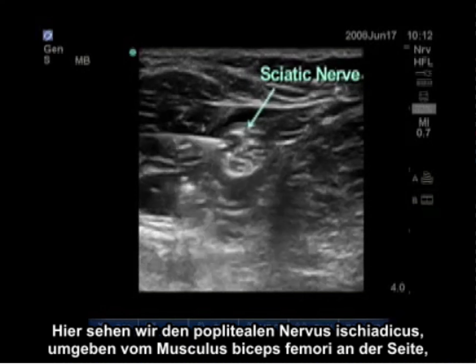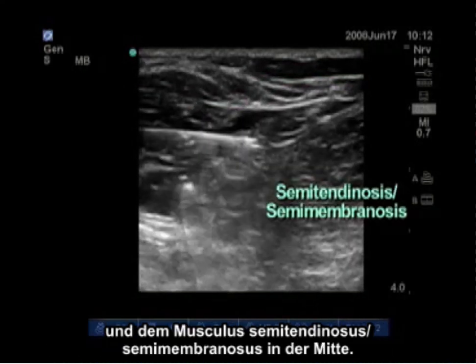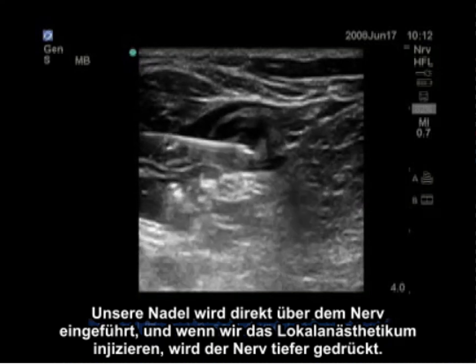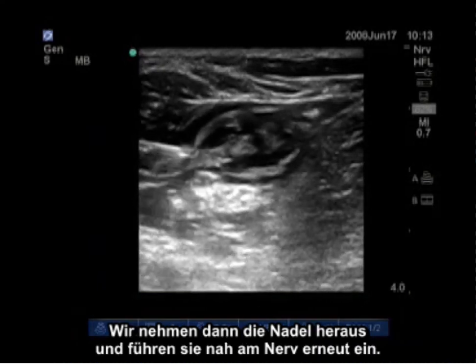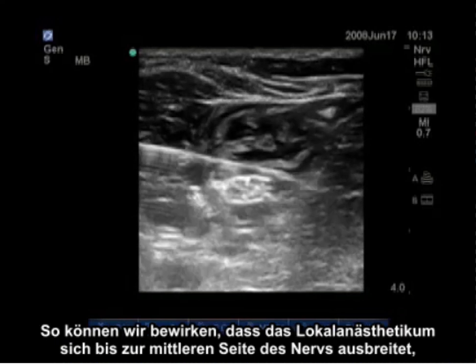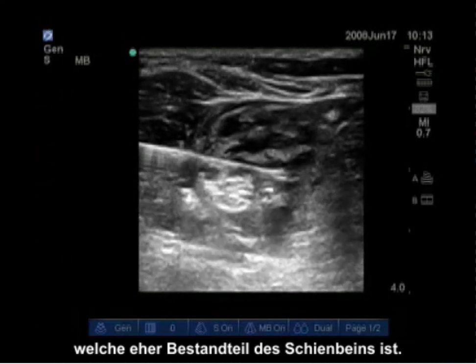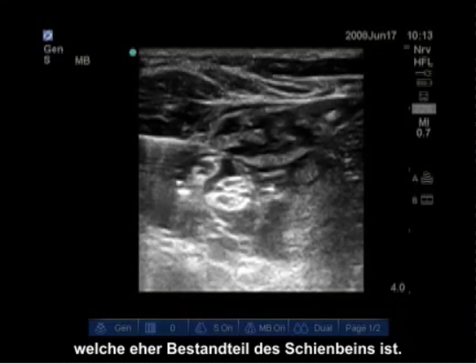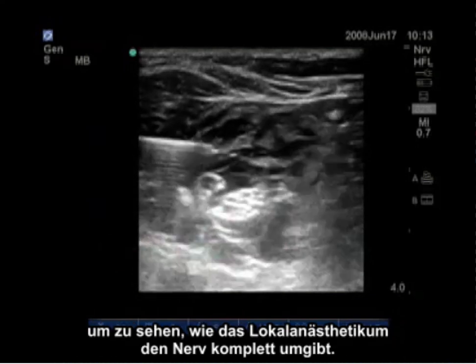Here we see the popliteal sciatic nerve surrounded by the biceps femoris laterally and the semitendinosus and semimembranosus medially. The needle is advanced directly above the nerve and local anesthetic is injected, pushing the nerve deeper. We then withdraw the needle and re-advance it close to the nerve so we can get local anesthetic spreading to the medial side of the nerve, which is more of the tibial component. Now you can visualize both the peroneal and tibial components with local anesthetic completely surrounding the nerves.